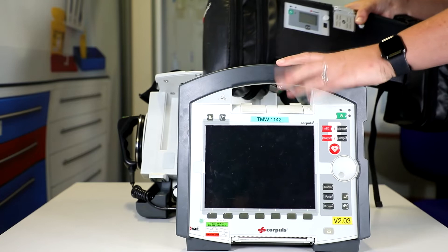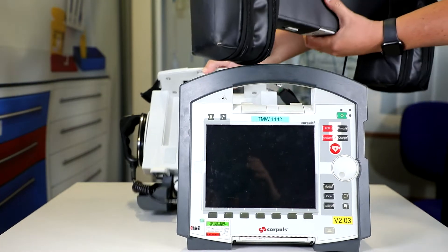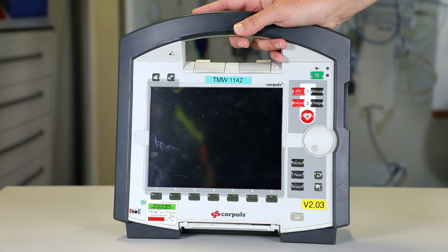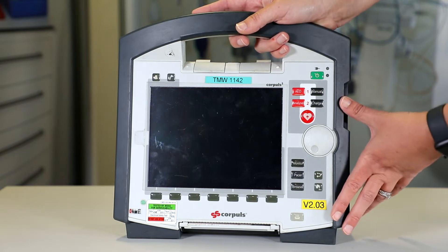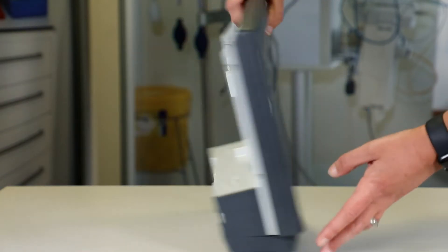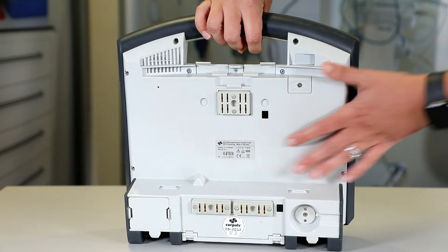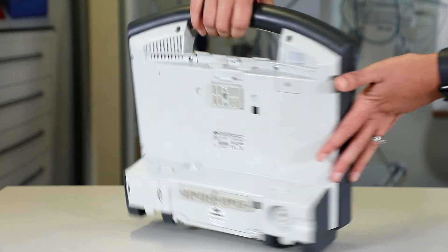The first thing I'm going to check is the patient monitoring, so I can remove the other parts out of the way. So we're going to look at the physical checks. First, I'm going to check for any dirt and damage, having a good look at the monitor here, turning it around, checking for any dirt, spillages, or anything on the patient monitor.